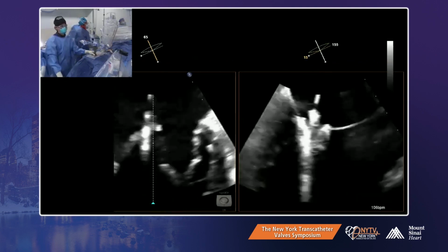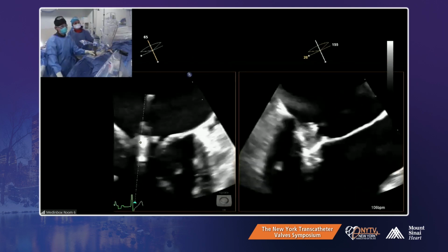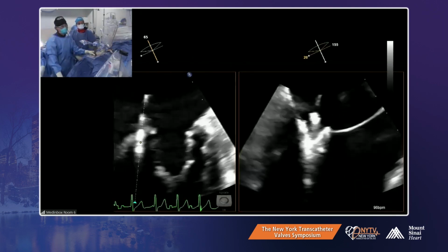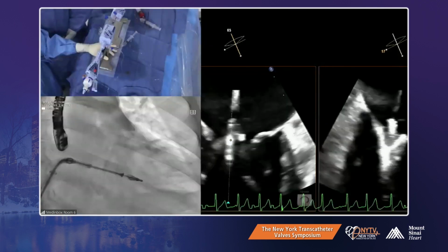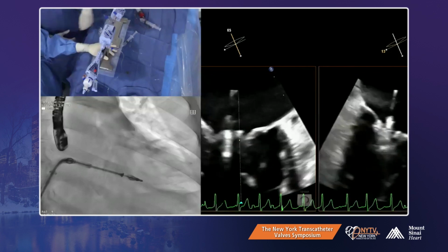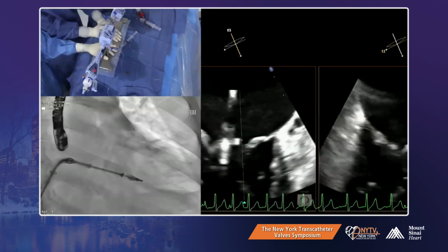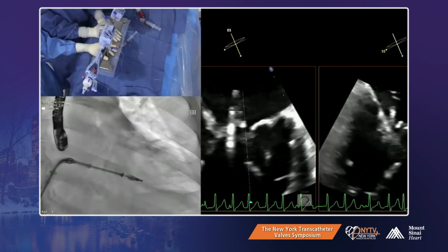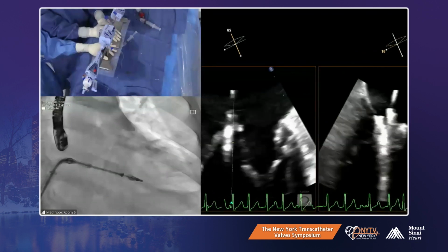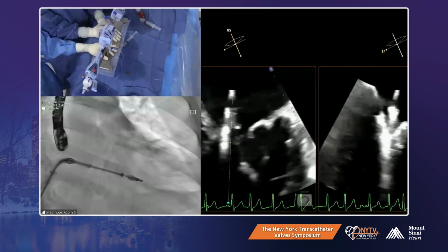Yes. I think that looks all right. Go lateral to the clip, please. Let's see how the leaflet looks. We sometimes look at the leaflet lateral to it as a kind of an eyeball to see how much is really in. Okay, it doesn't look like it's buckled.